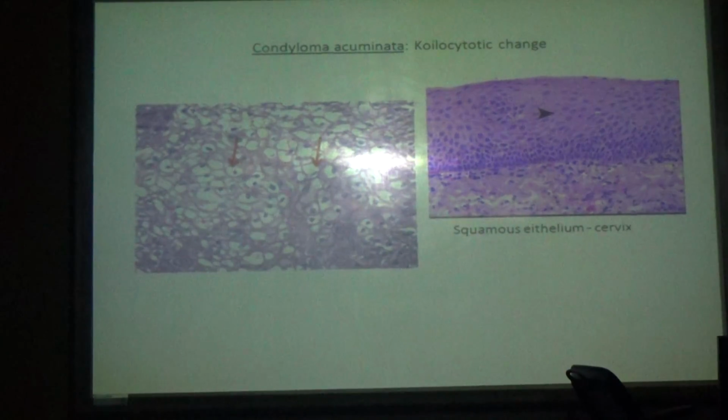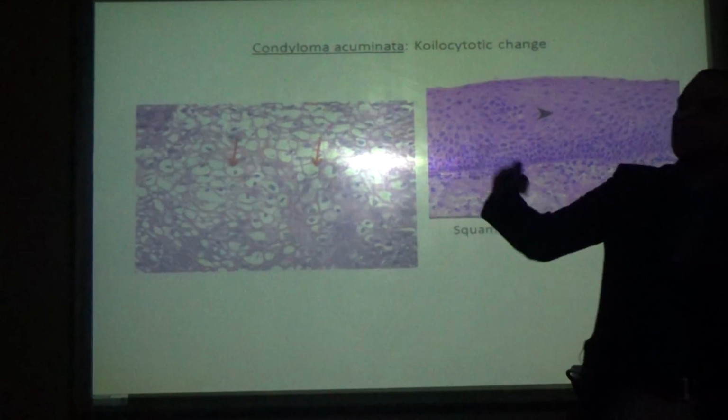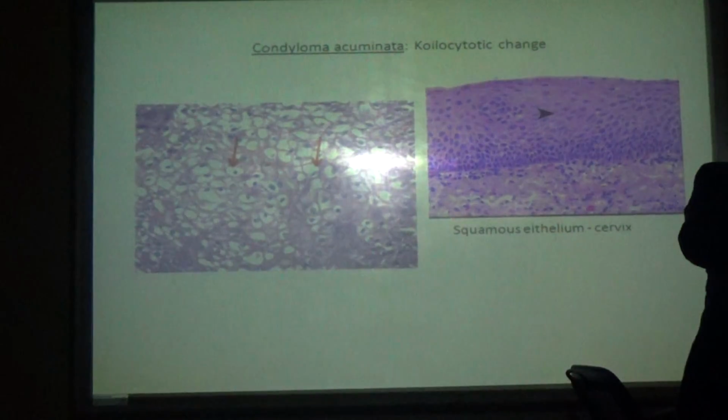Okay. Cervix has a two-layered epithelium. There are two parts: one is the ectocervix, another one is the endocervix. Then from the endocervix, the endometrium starts. It's a U-shaped uterus. Then at the end, you will see the cervix.